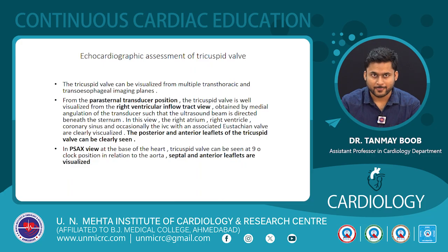tricuspid valve. The second view to visualize the tricuspid valve is the modified parasternal short axis view, and in this view the tricuspid valve is seen at the 9 o'clock position as compared to the aorta. And in this view, two leaflets, septal and anterior, are visualized.